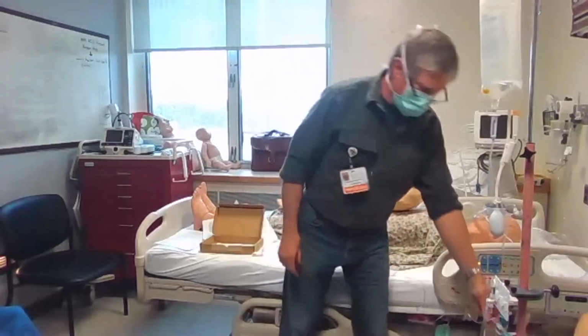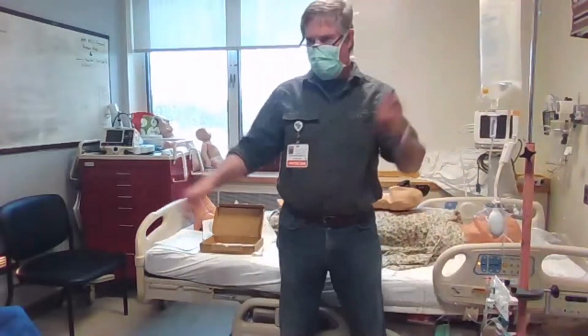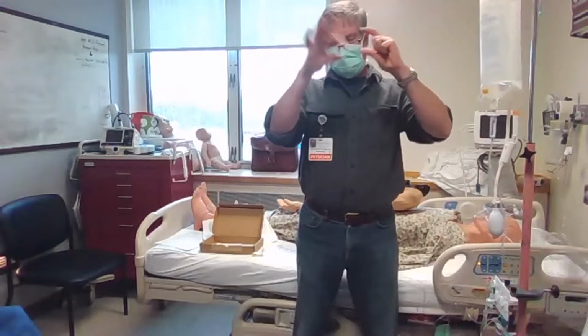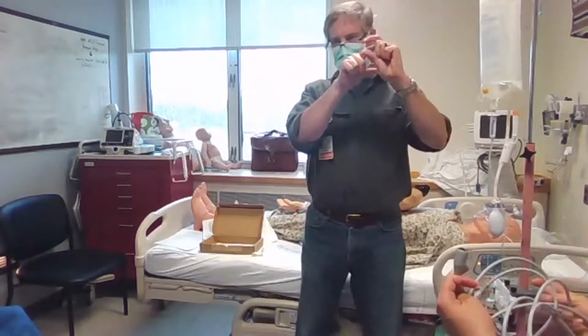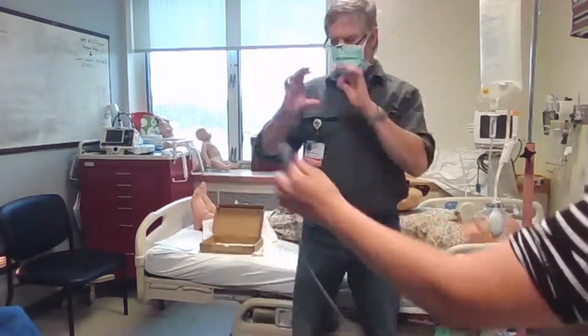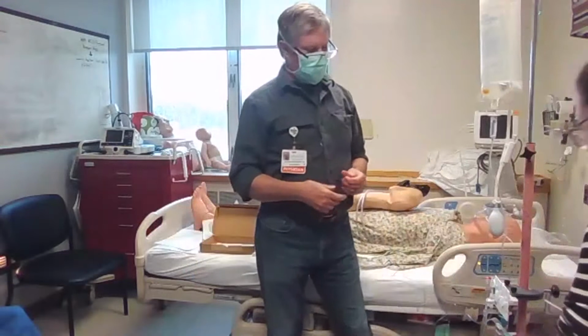There's also the box that the cable goes into, that great big cable. There are two buttons on that. One is press, which just kind of resets everything, and the other one is 0, and you can just push it there as well. It's just the little box, like you see on the Philips monitors.